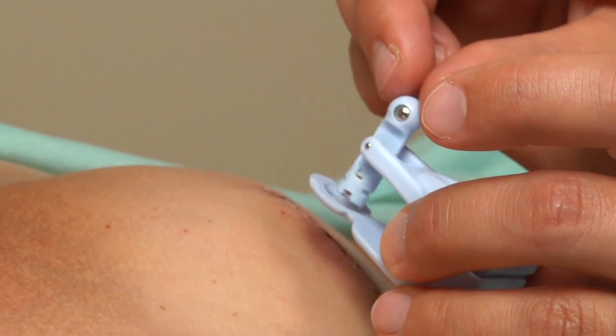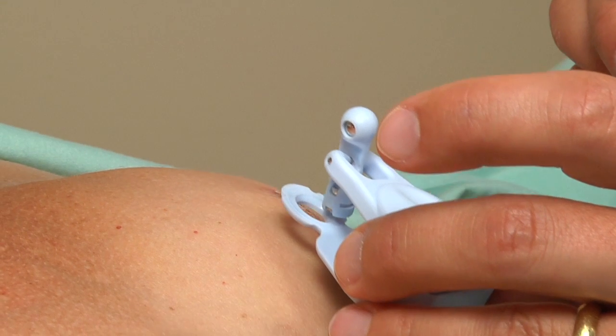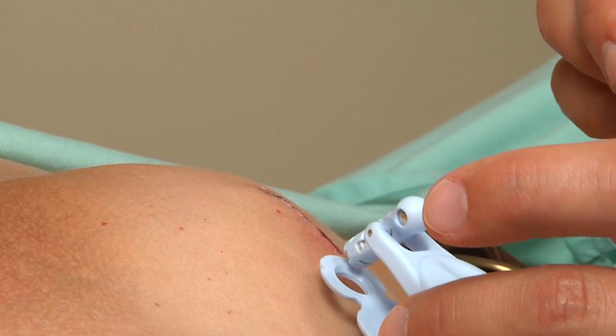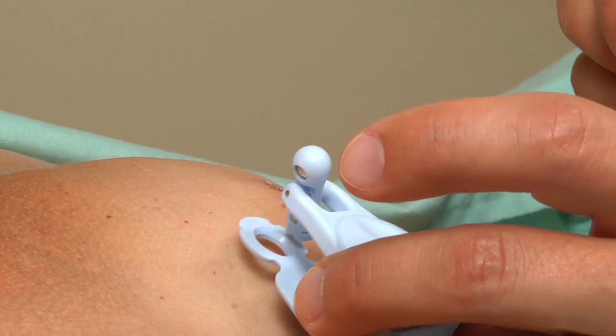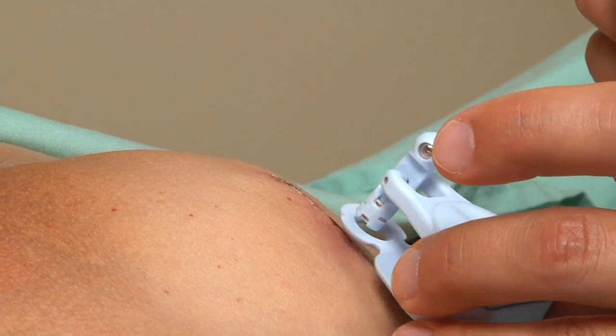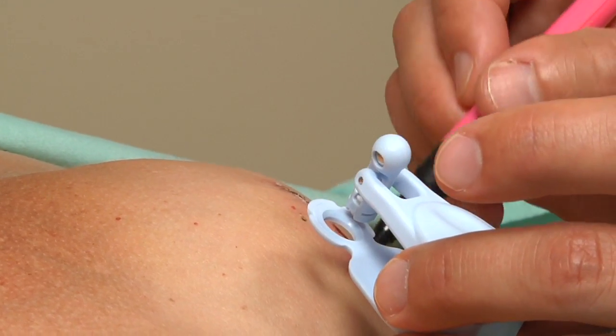The magnetic toggle should be tested to see that it moves freely. The location of the injection site can be seen by moving the Magna Finder in two 90-degree planes and then marking this with a marking pen.